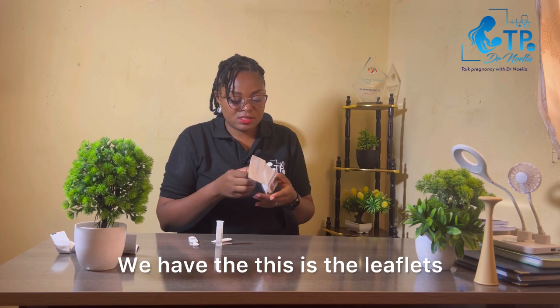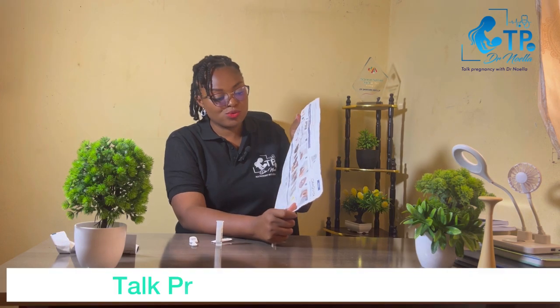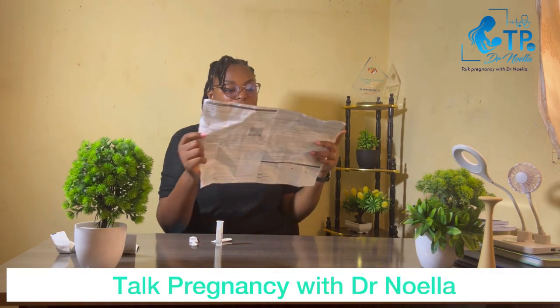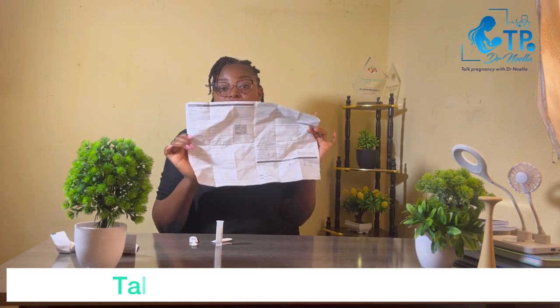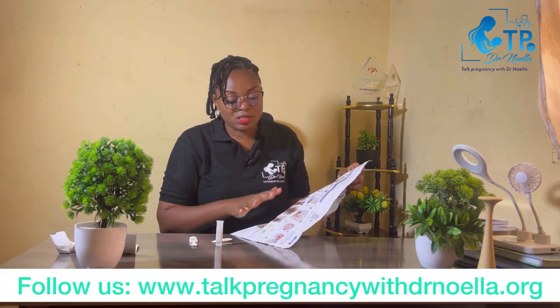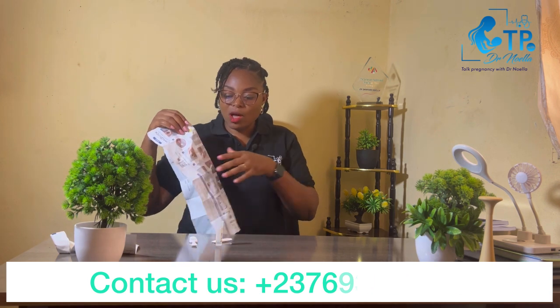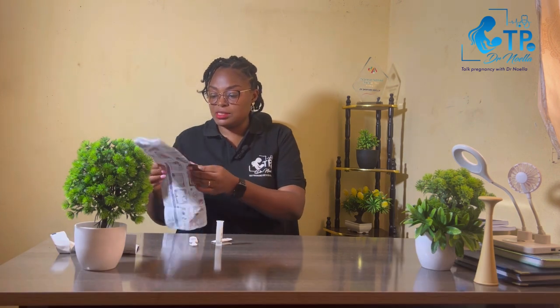Inside the kit you have a leaflet where you can read and see exactly how to do the testing. There are different types of kits, so ensure that you read the leaflet specific to your testing kit. Once you've reviewed the leaflet, set it aside along with your equipment that you'll be using.